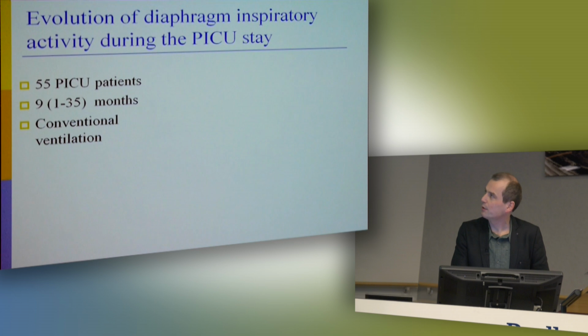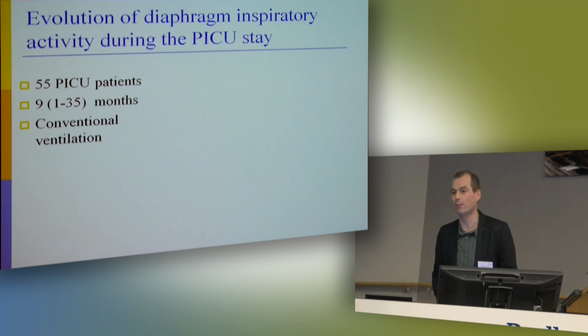So we included 55 PICU patients in whom we monitored the diaphragm activity, not every day, but at 4 different moments in their PICU stay. In the acute phase, which was not really acute, it was not at the time when the patient was completely sedated or paralyzed.